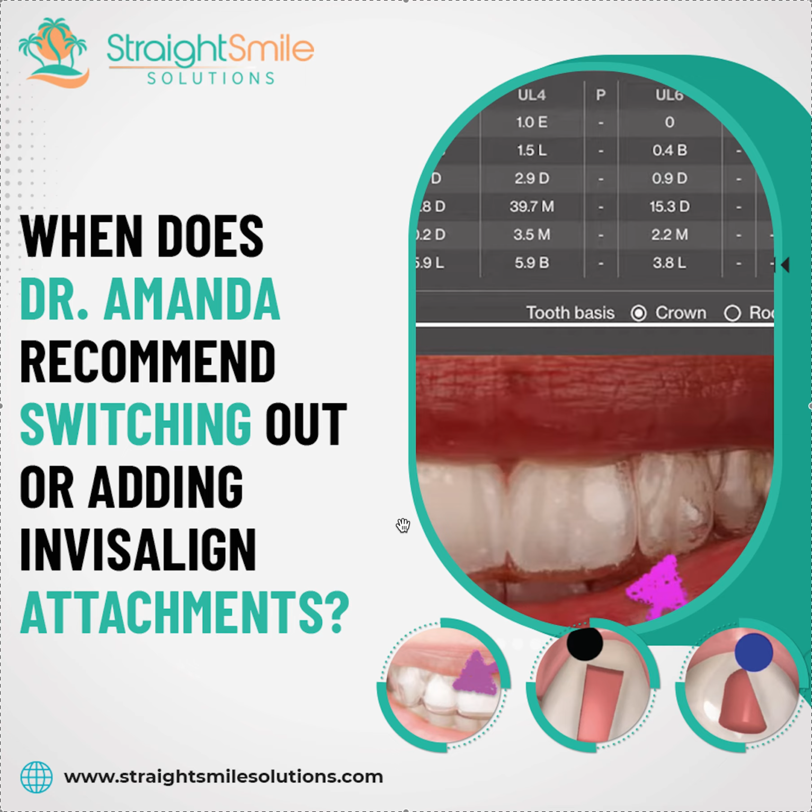I don't do attachmentless aligners, like never. It just doesn't work, especially anterior attachmentless aligners. And a lot of you are making promises that you can't keep. So just say no. If they want to do that, they can go DTC, and then if it doesn't work, that's on them. So do not start a case where they're refusing attachments. It's going to be a nightmare. It's going to be unpredictable. It's going to take them 3 times as long as you expected, and the patient's going to be mad because you promised them something that you can't deliver.